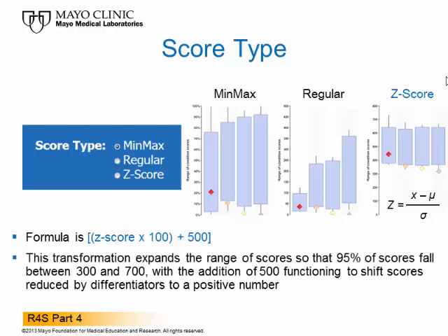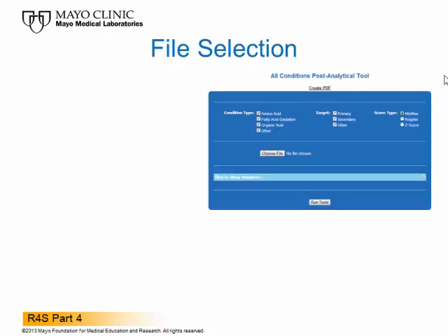The application of Z-scores will become increasingly more important once the next version of the software, for convenience referred to as version 2.0, is completed, and will be further discussed in Part 6, the last segment of this series. If the all condition tool is accessed without previous processing of a batch file, it might be necessary to upload a single case CSV file.